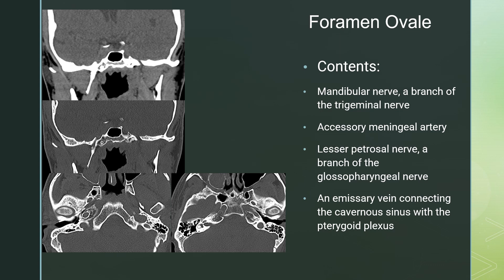Foramen ovale includes the mandibular nerve, the accessory meningeal artery, the lesser petrosal nerve, and an emissary vein connecting the cavernous sinus with the pterygoid plexus. On the coronal view, you can see foramen ovale as a defect within the skull base. It can be straight up and down or go somewhat at an angle. Here is Meckel's cave with its CSF density above that defect in the skull base, which is foramen ovale. On the axial images, you are looking for a well-circumscribed peripherally sclerotic foramen anterior to the tip of the petrous bone at the level of the clivus. Here is foramen ovale on the right, and here is foramen ovale on the left.